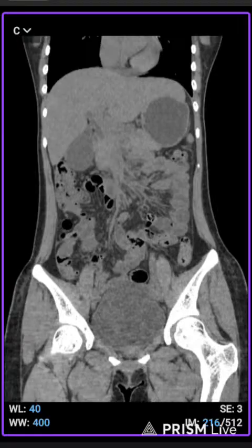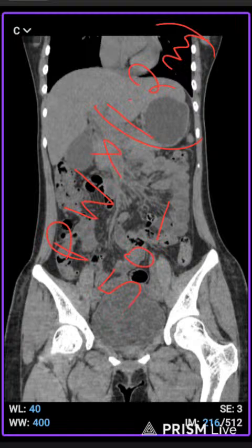You have to plan according to the patient weight, multiplied by 1.2 ml. If the patient weight is 50, you multiply 50 by 1.2, so maybe 60 ml.